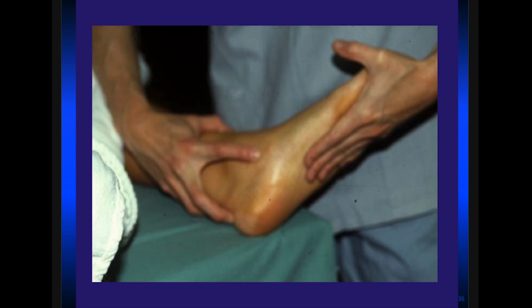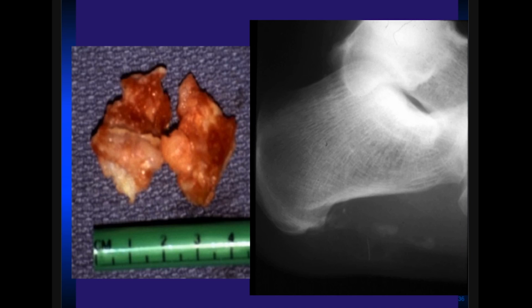This is what he looked like at the time of the excision. Pretty normal exam. And then this is what the pieces look like when they were excised, and then the new lateral radiograph. And he did very well after excision of this, no recurrence of ectopic bone.